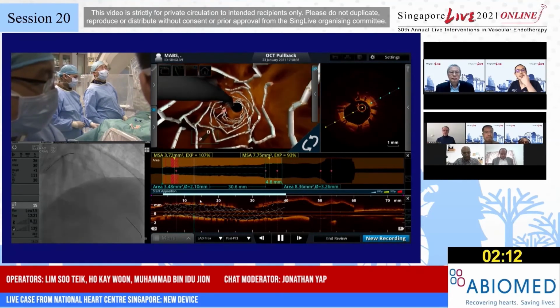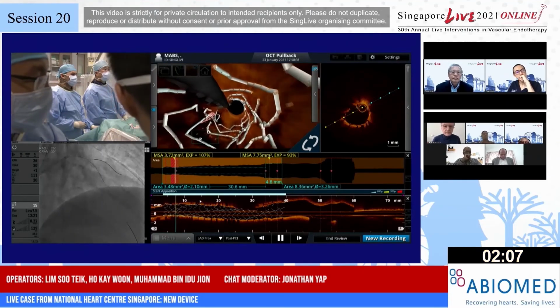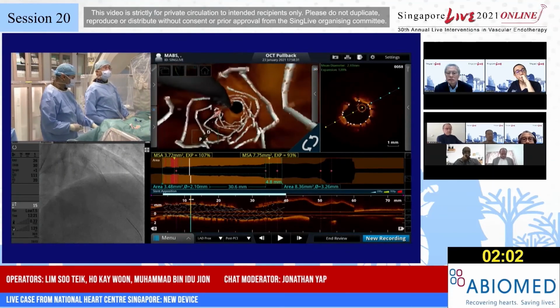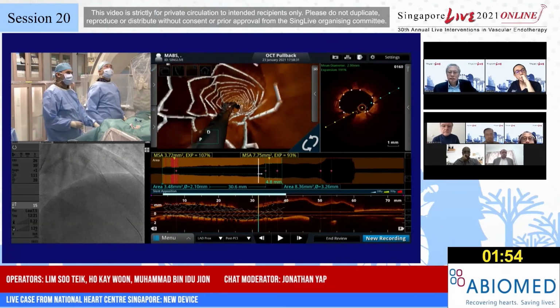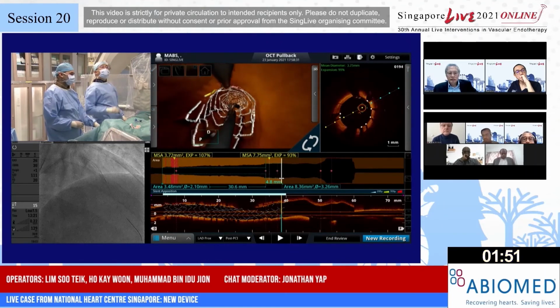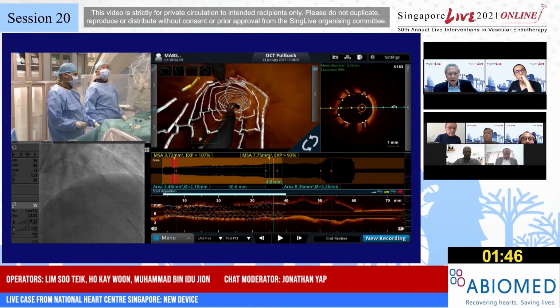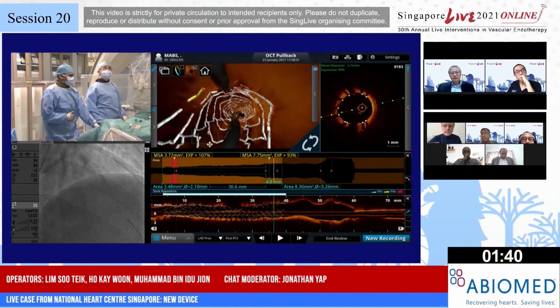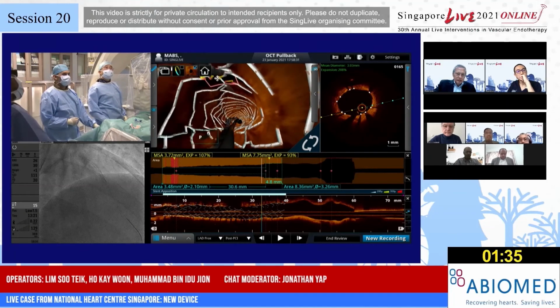So this is just a fly-through view showing again the stent from inside out, from inside the coronary lumen. It looked very much like the usual metallic. We are not able to tell exactly the uncaging element, which is located at the low stress area, near to the sinusoidal ring. And in a newly implanted stent, we are also not able to demonstrate that pulsatility. This one we need to wait until it gets uncaged.